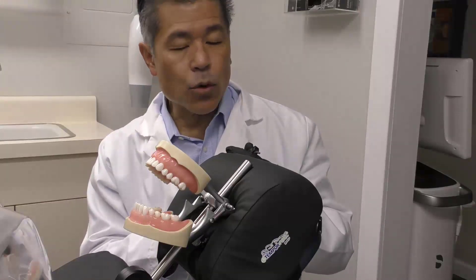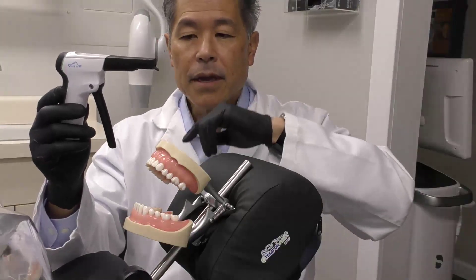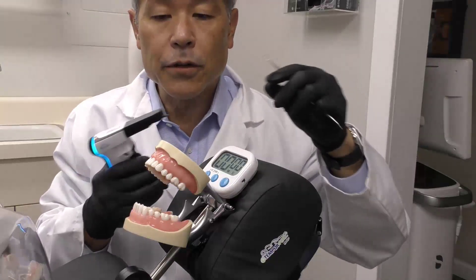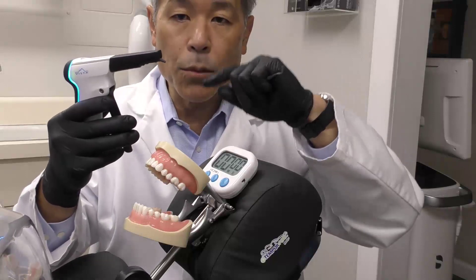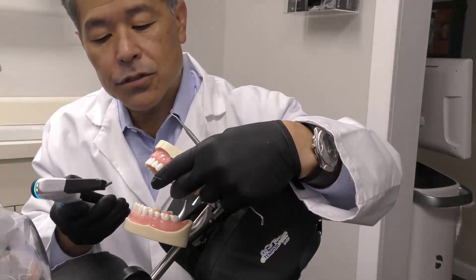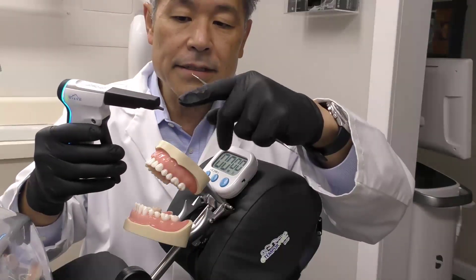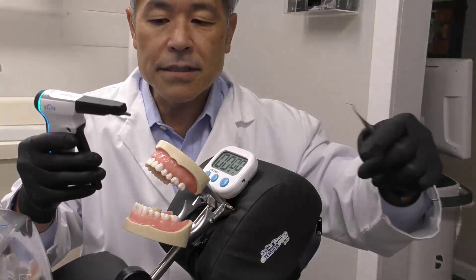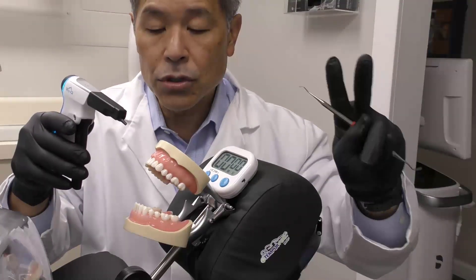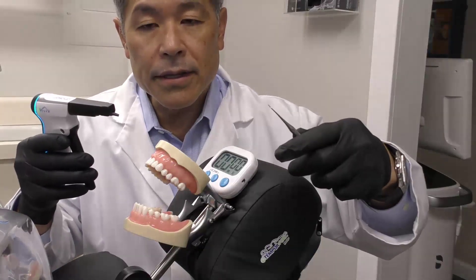One workflow issue I want to illustrate is that with the Phaser, we only have one compule. What if we're doing a multiple-compule case? The Phaser can only warm one compule at a time, so I'm going to simulate filling a large cavity in a posterior tooth that requires multiple compules. I'll express the entire contents of the compule out, give it to my assistant — my assistant will change the compules and keep the Phaser running so it will be warming compule number 2. As I'm contouring the composite and curing it, we'll see how long that takes.